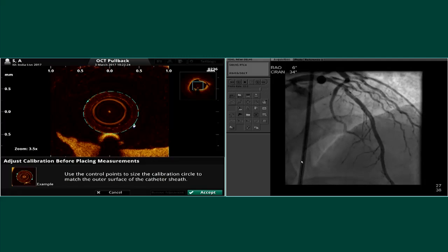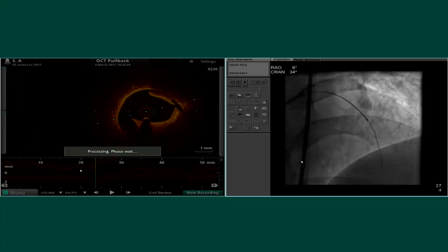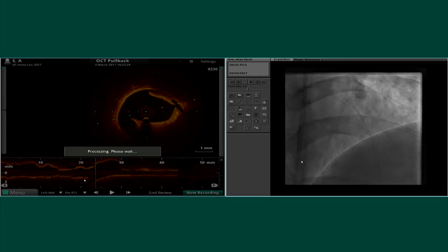So the size of the vessel would be close to a 4, 3.75 to 4.